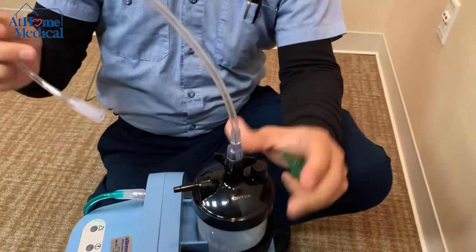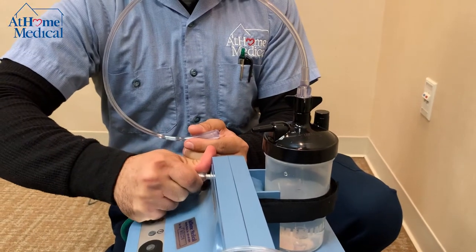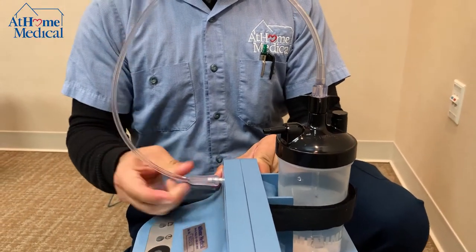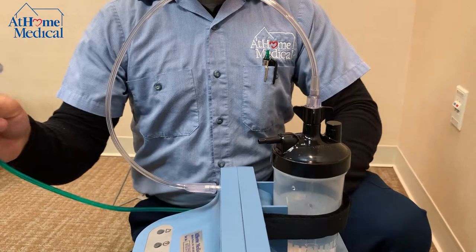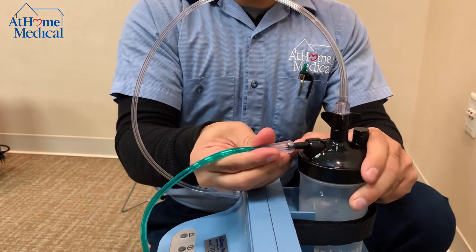The other end of your tube would connect to your oxygen concentrator, and then your tubing would connect to the output on your humidifier bottle.